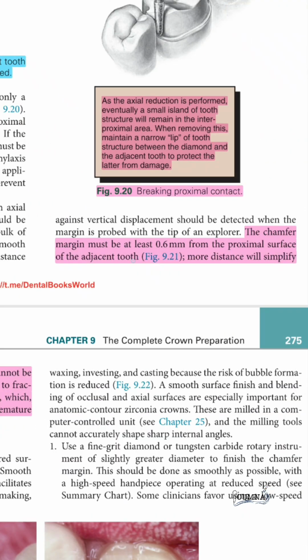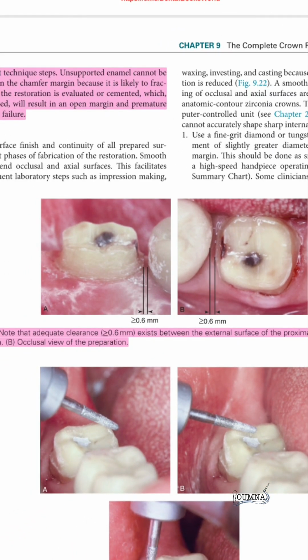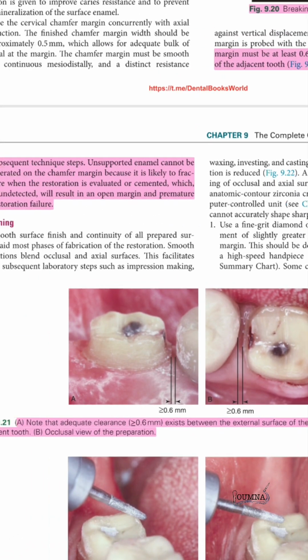The chamfer margin must be at least 0.6 from the proximal surface of the adjacent tooth. It means that this is the chamfer margin. We must maintain 0.6 millimeter of space to give space for the proximal contacts to be built by the technician.